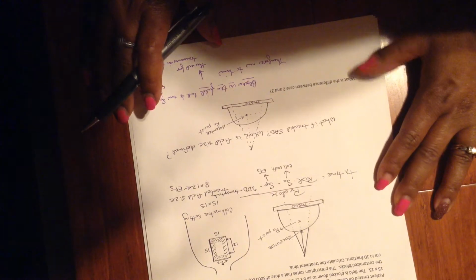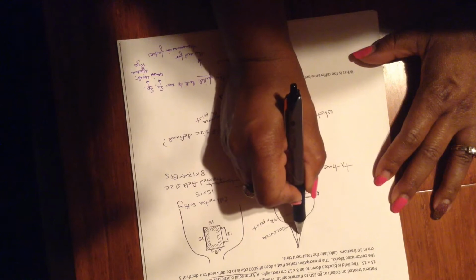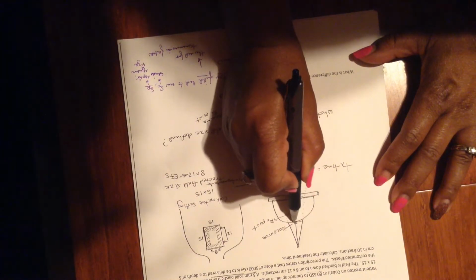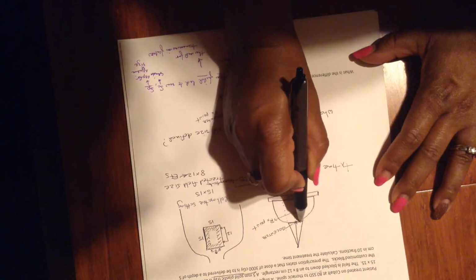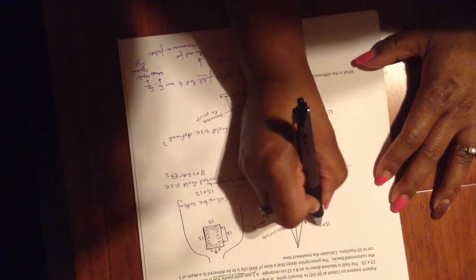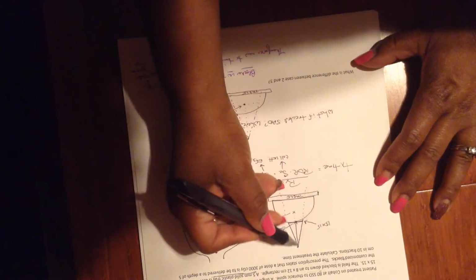Because the beam is divergent, the field size changes as you come away from the source. So when we're at isocenter, if the collimator is set 15 by 15, the 15 by 15 is here. At any points closer to the source, this size is smaller.